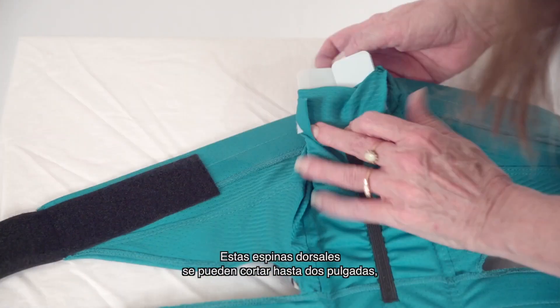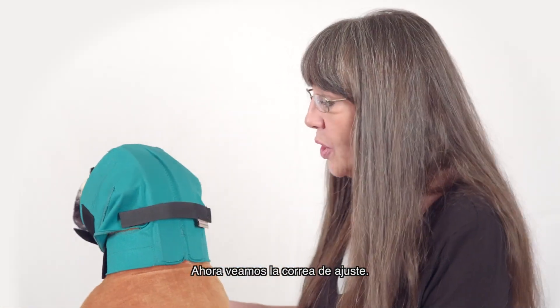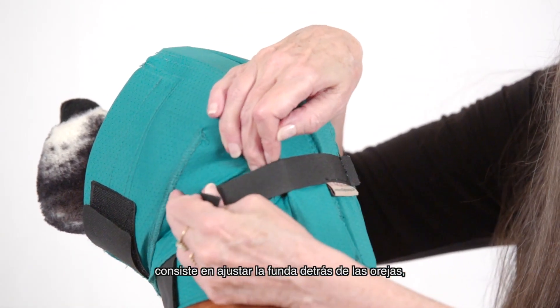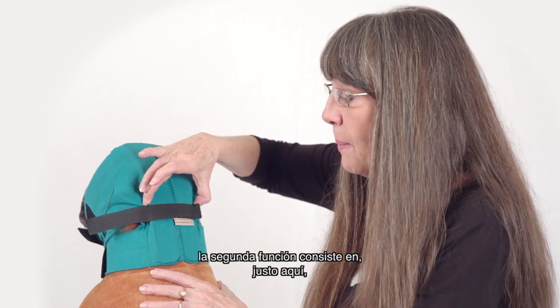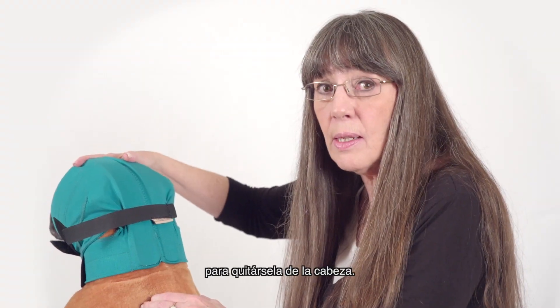These spines can be cut up to two inches to custom fit your dog. Now we come to the cinch strap. It has two functions. The first function is to tighten up the wrap behind the ears, cradling them in place. The second function creates a bottleneck that stops the wrap from being able to be pawed forward off the dog's head.